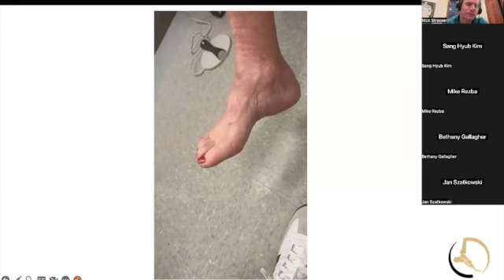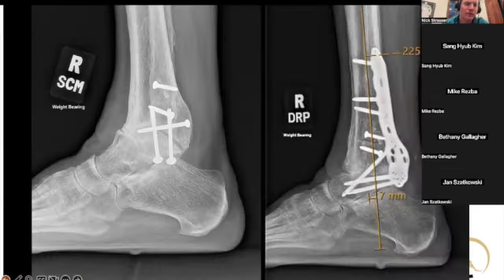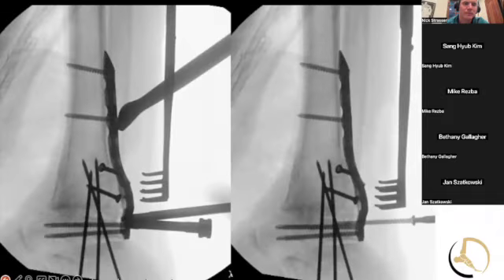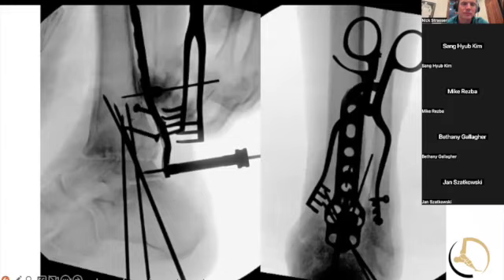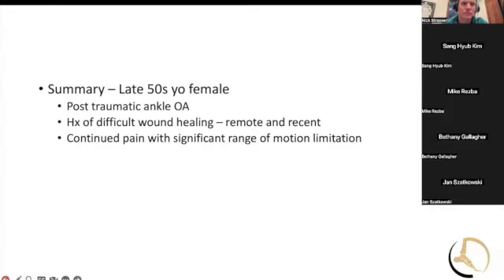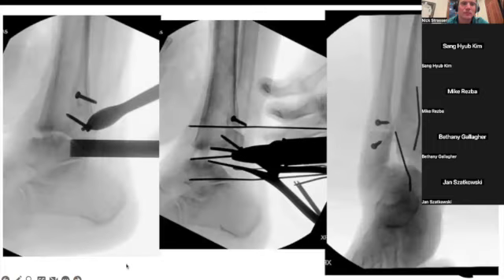Hey Nick, can you go back to your intra-op film? Yeah, of course. Okay, keep going back. Can you say the instruments that you used here, what you had available and everything? Because I think these are key things. It's not just plates and screws in the end. Yeah. So at this point, I think I had a couple of distractors in there.